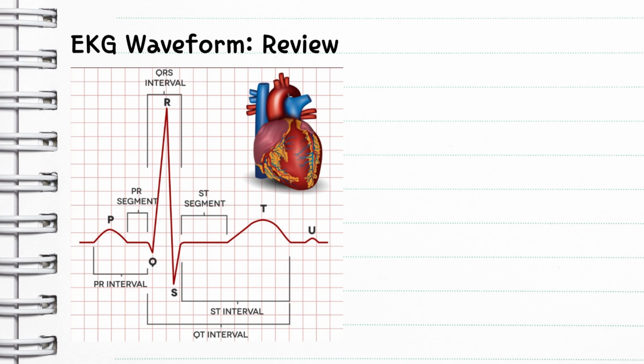So when your potassium's high, that T wave is going to be peaked. It's going to go way up high and then come down low. That's a sure sign right away. You're like, oh, something wrong with the kidneys. Is something going on here? Whatever, just looking at the cardiac monitor.